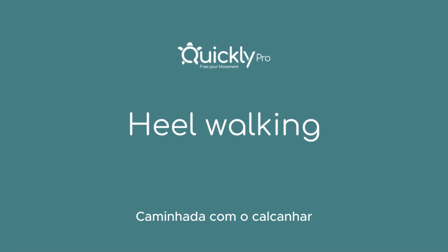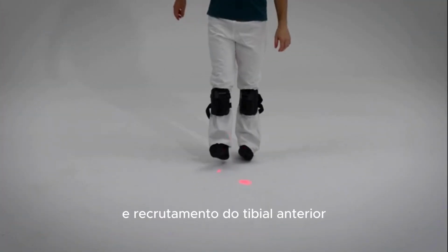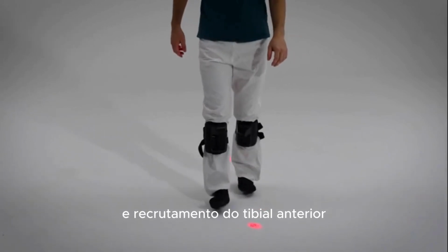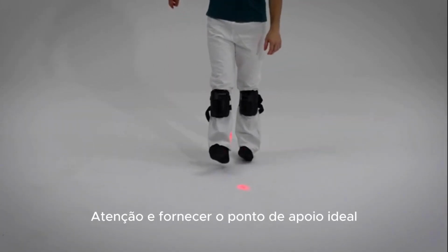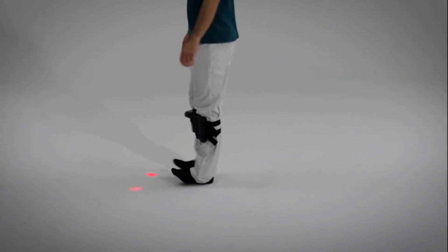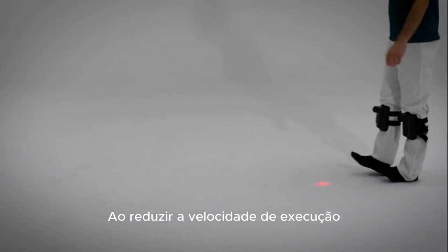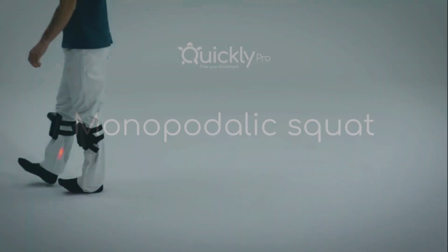Heel walking. Specific exercise useful for stimulating dorsiflexion and anterior tibialis recruitment. Visual feedback helps to maintain attention and provide the ideal foothold by acting on the postural and balance system. By reducing the speed of execution, the monopedalic time is amplified, working on dynamic balance.